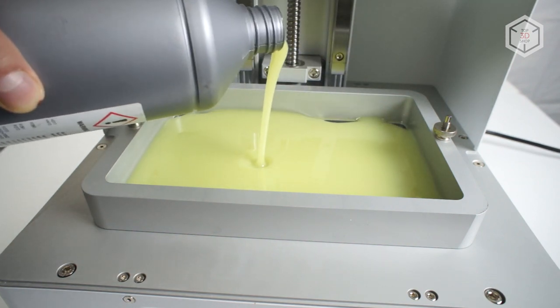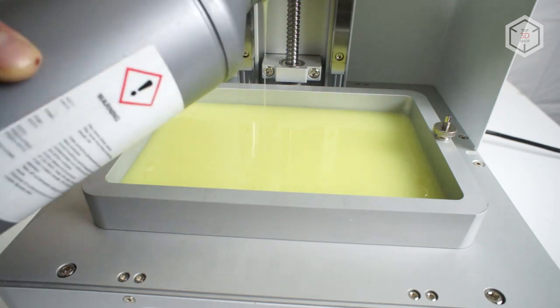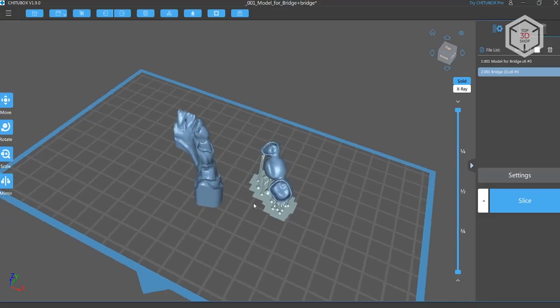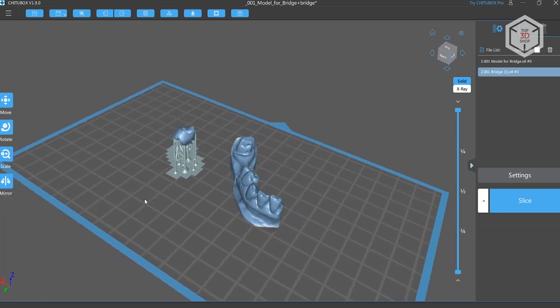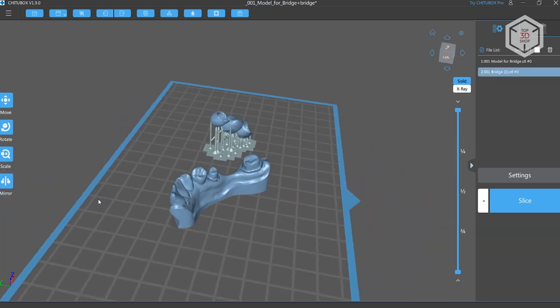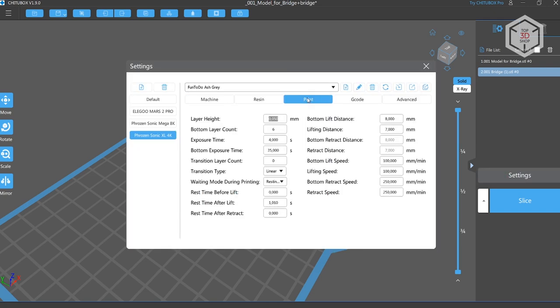In a yellow color, it's designed for printing demonstration and master models of teeth, aligner thermoforming molds, etc. We sliced a small model with teeth in ChituBox and a separate model of the bridge, which should be connected to the teeth. If you plan to upload a prepared file via a local network when slicing a model, there is no need to configure the exposure time and movement speed in the software. All of these settings will be used from the resin profiles in the web interface of the printer.